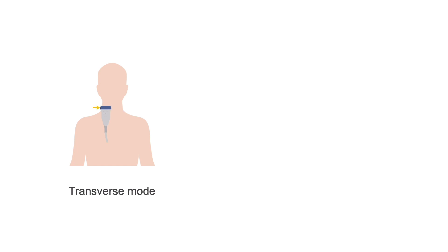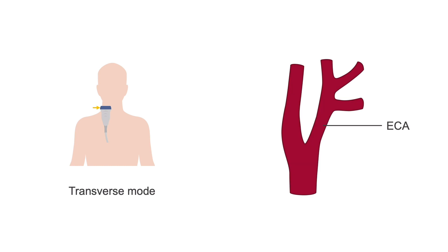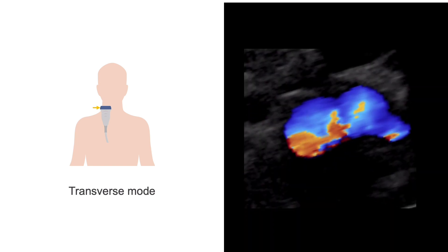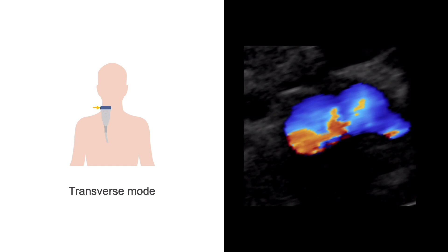To help identify these arteries, first look at the right side of the patient's neck, keep the probe in transverse, and try to locate the ECA. One key difference between the ECA and ICA is that the ECA has branches, whereas the ICA doesn't. The colour flow can be used to help identify the branches of the ECA.